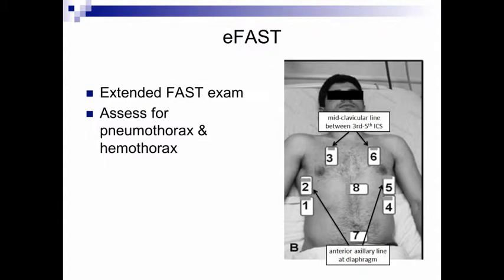Just going to touch briefly upon this EFAST. So if you spend time on a trauma service or in trauma ICU, you might hear them say, "Oh, EFAST," or "We performed an EFAST exam." And all that the EFAST means is that it's an extended FAST exam.